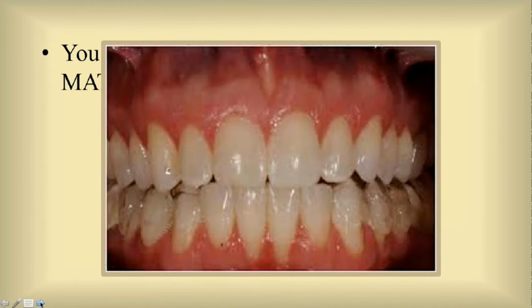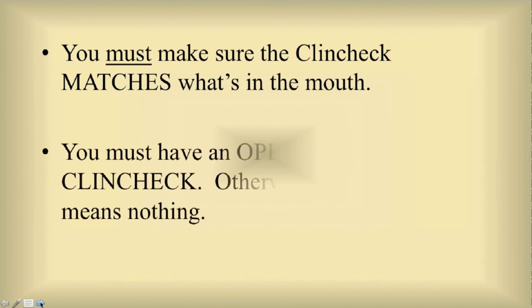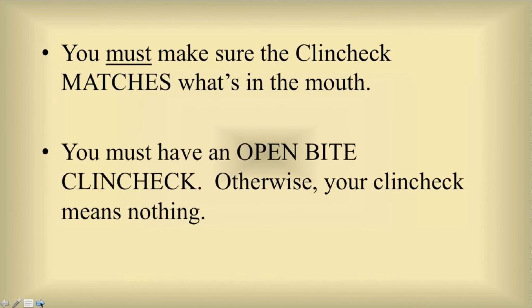And communicating that to the technician does take some effort. You have to have an open bite in that ClinCheck. Otherwise, your ClinCheck means nothing. If your ClinCheck comes back and it's closed, you don't have a ClinCheck that's even worth talking about.